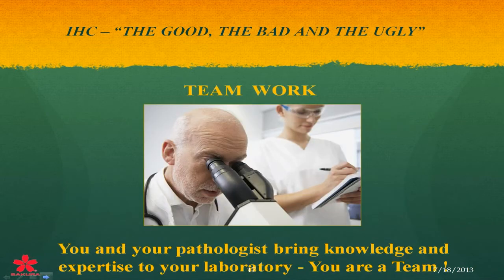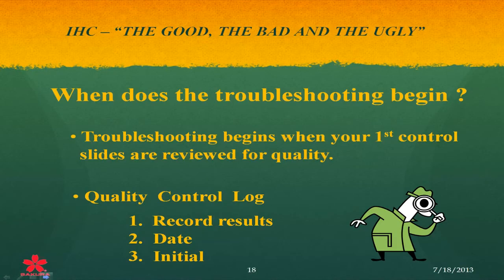Teamwork is very important in our laboratory. You and your pathologist, you bring your knowledge and your expertise to your laboratory. And always remember, it's teamwork. You work as a team, and you are a team. When does the troubleshooting actually begin? Troubleshooting begins when your first control slides are reviewed for quality.